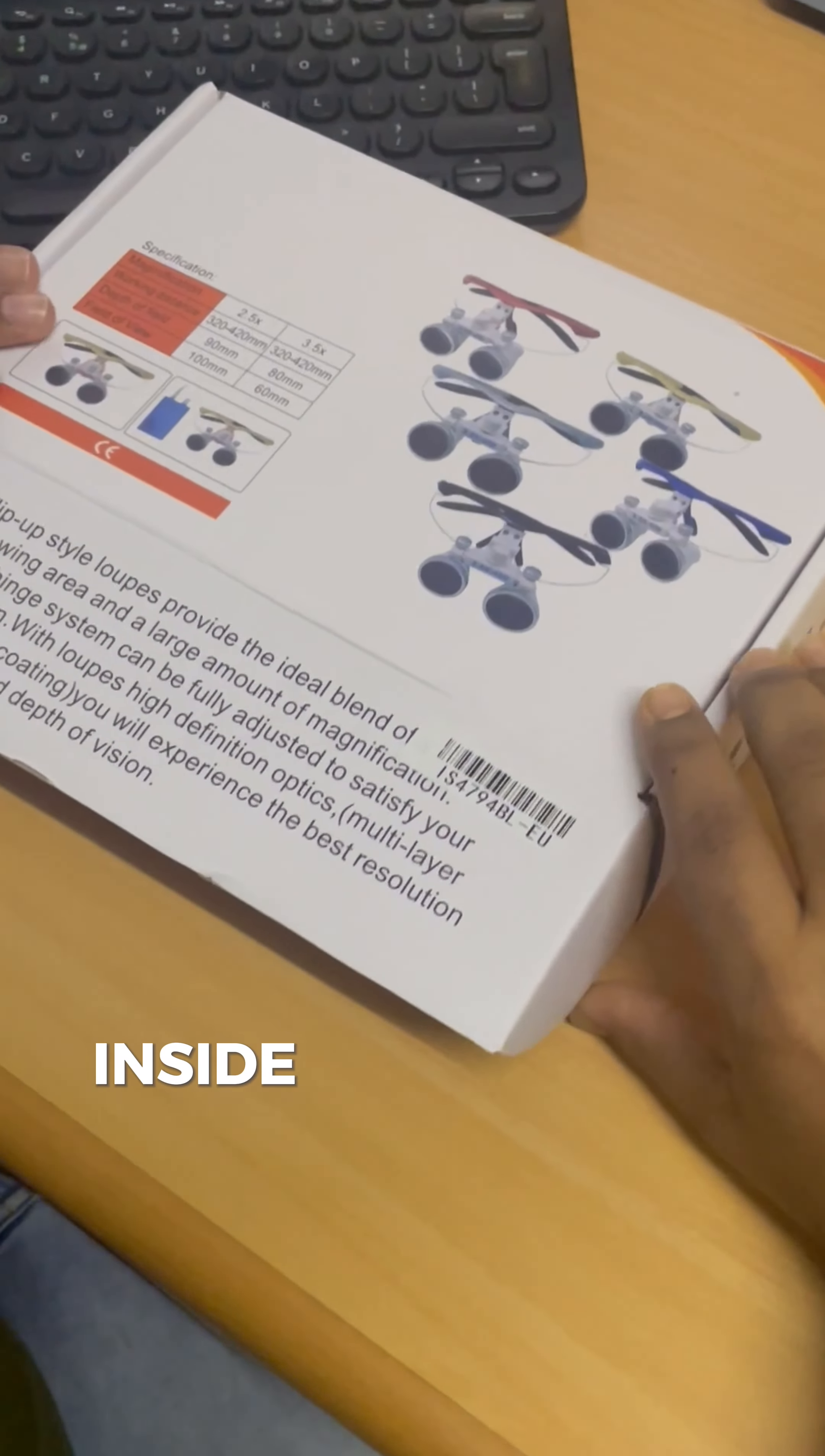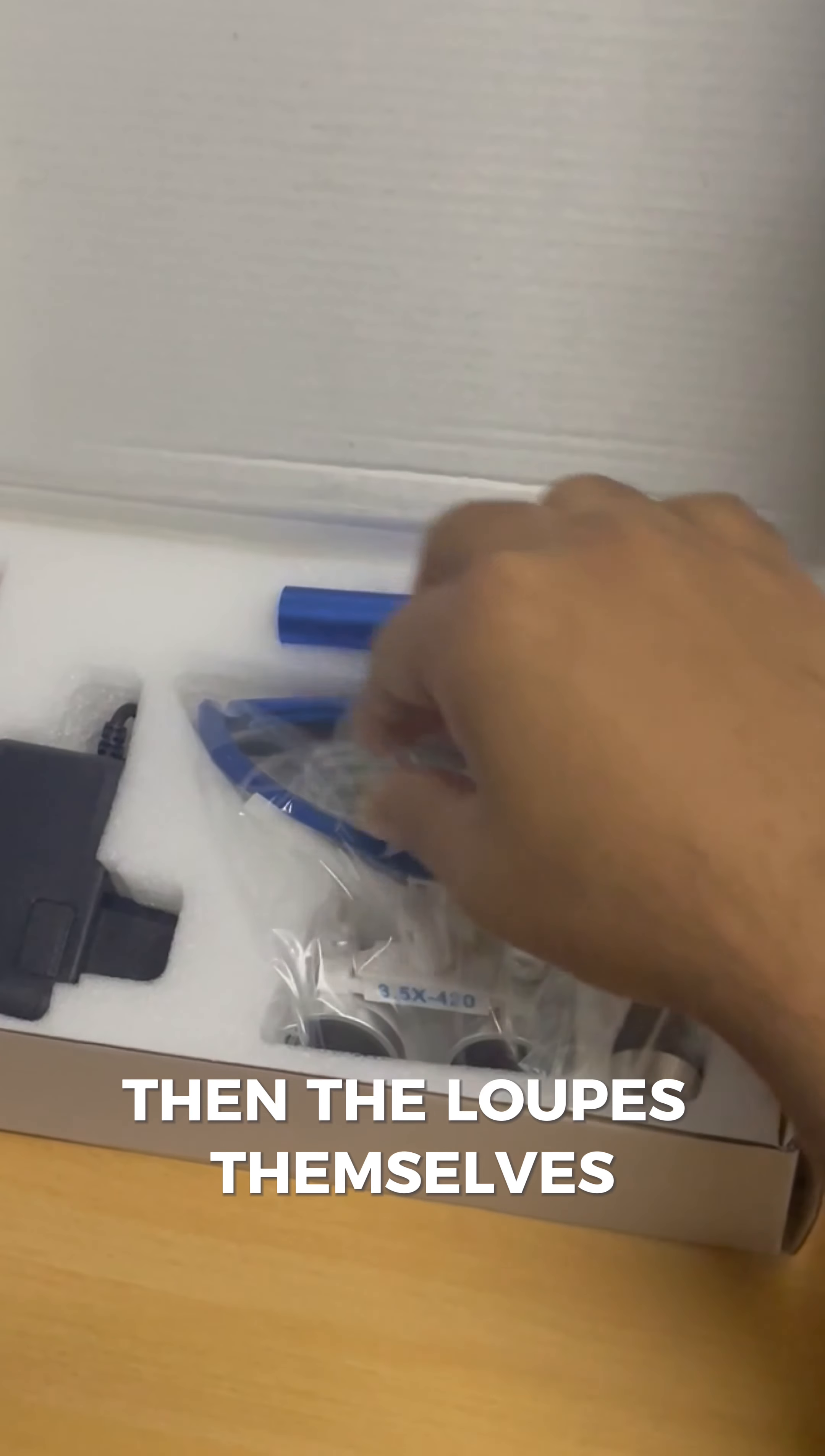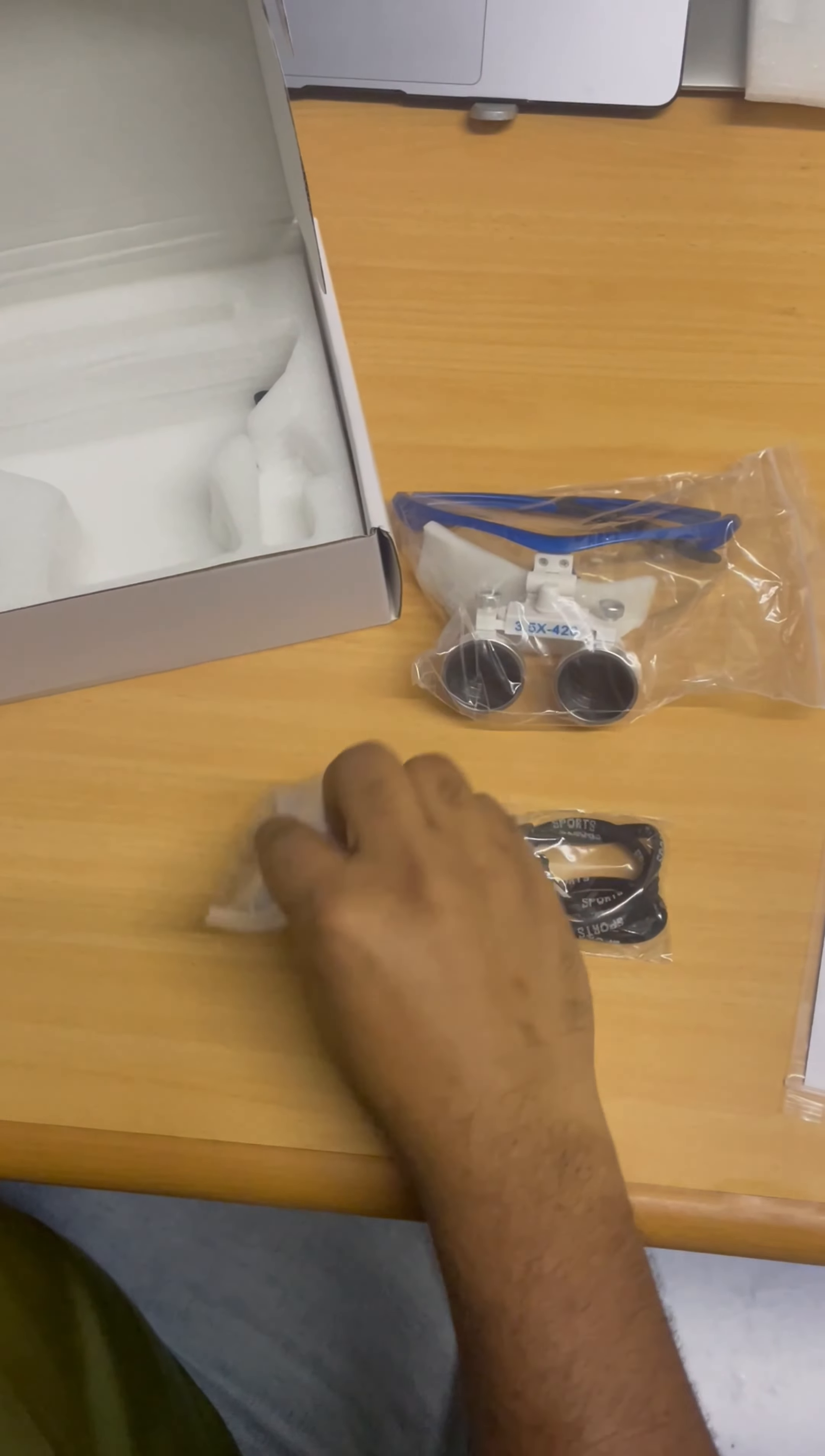Inside the box, you will find the user manual which will give you more details on how to make finer adjustments, then the loupes themselves, a charger for the headlight battery, a small screwdriver, the LED headlight, the battery and the neckband with the cleaning cloths.